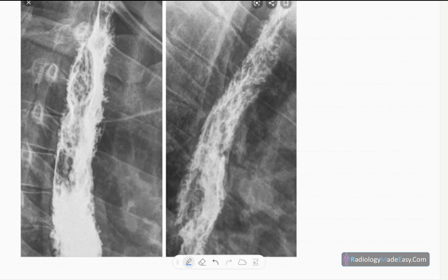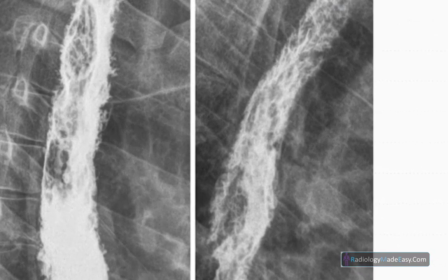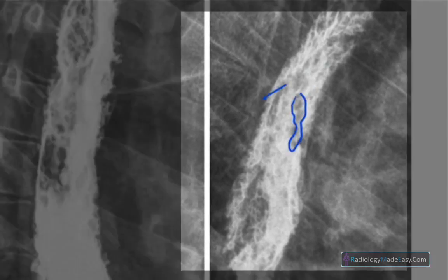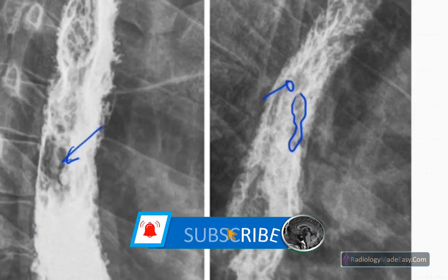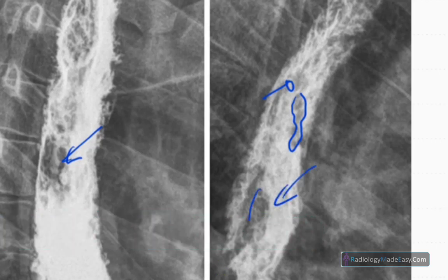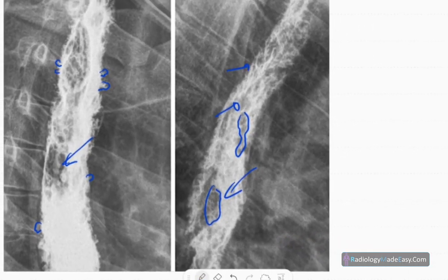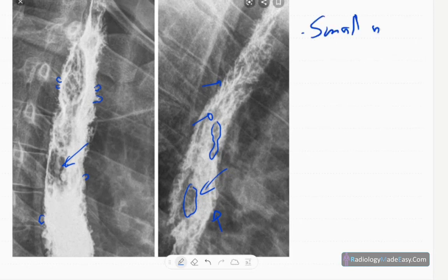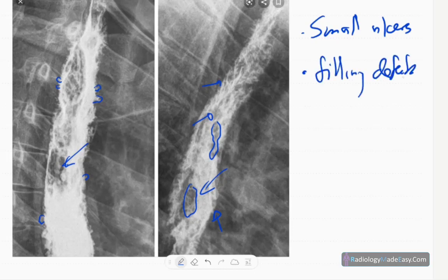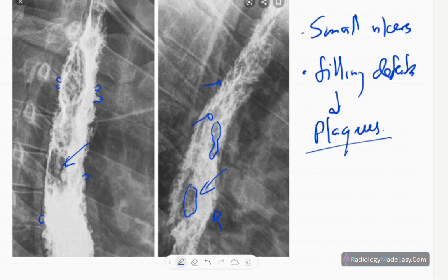There are a few abnormalities in the spot images. You can see some linear filling defects here, and also some linear filling defects here as well. Apart from those filling defects, there are outpouchings of contrast into the lumen — multiple small outpouchings. Those are small ulcers, and there are also filling defects due to plaques or projections from the wall.